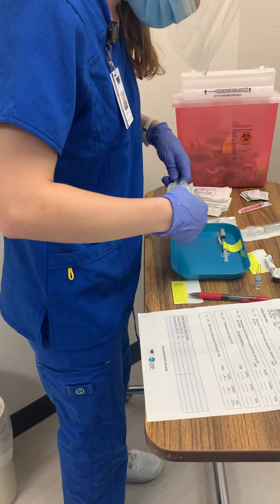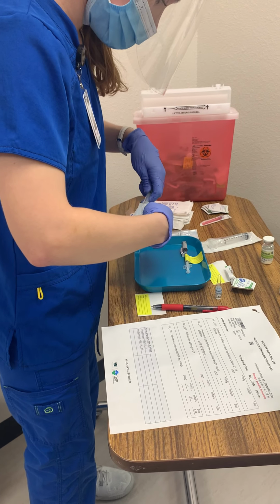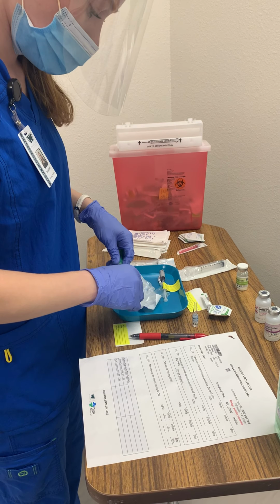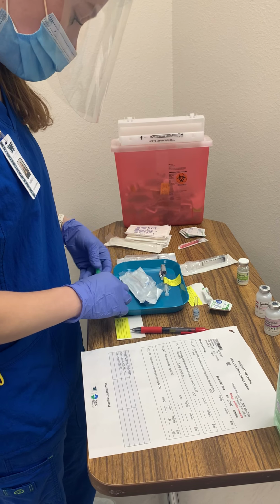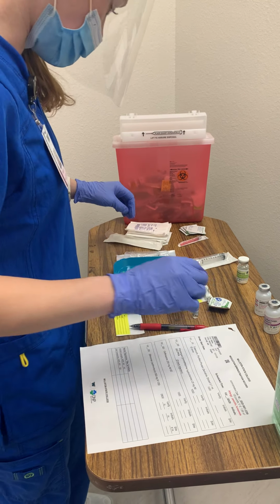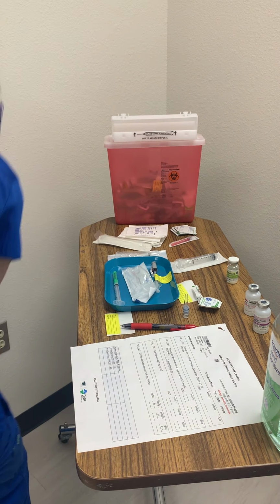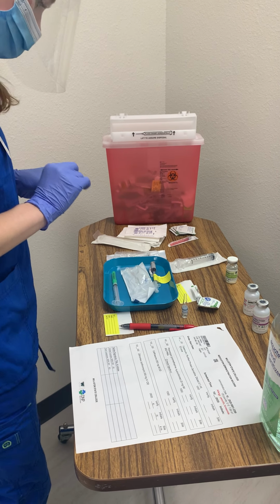Perfect. Now this filter needle is on here so that when I draw up in my ampule, there are no glass shards or anything. So I'll leave that, and then I'm gonna get my gauze ready to break my ampule.